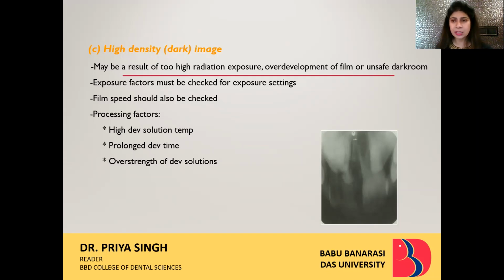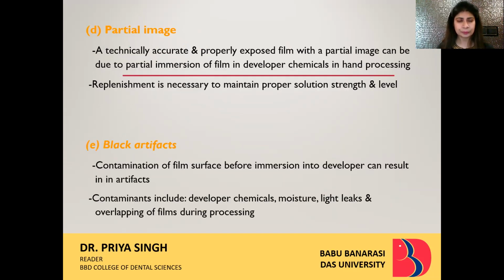Depending upon which season the radiograph is taken, again, as I told you, if the solution has been prepared afresh, then you know that it requires less time for developing, less time for processing, as compared to a solution which is depleted. So knowledge about the temperature of the solution and concentration of the solution is very important. Otherwise, it will lead to a light or a dark image. And again, you won't be able to do interpretation of either of the two.